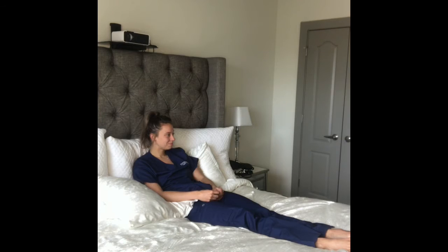You're welcome. So now I am going to perform the vital signs portion of my assessment using my patient. I'm going to start off with the temperature. A normal adult temperature is 96.4 to 99.1. A normal pediatric temperature would be 95.5 to 99.5. And first, I would have my patient making sure they're sitting up. I would place my thermometer in the posterior right or left sublingual pocket in their mouth, hold it, and wait till I get a temperature.